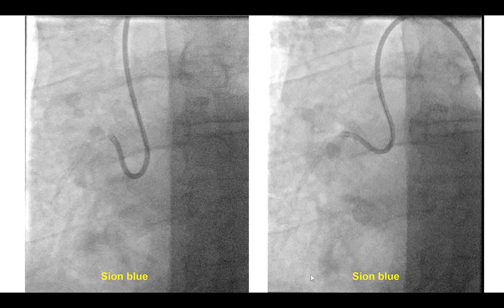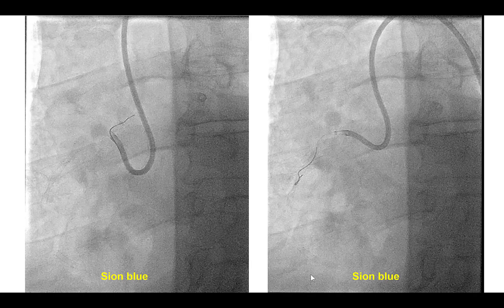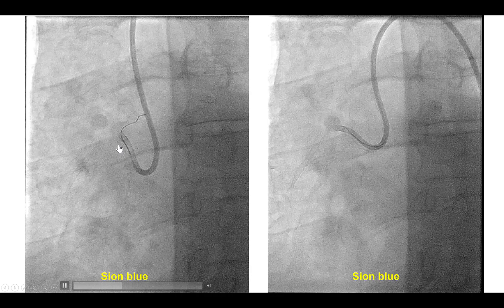It is also very important to use intravascular imaging, because unlike this case in which it was obvious that the stent was under-expanded, sometimes stent under-expansion can be hard to diagnose.